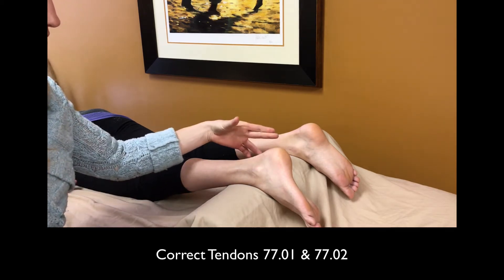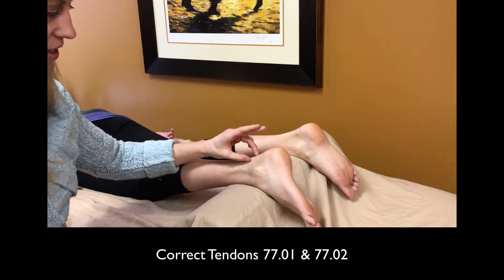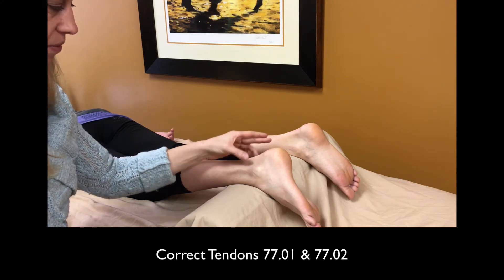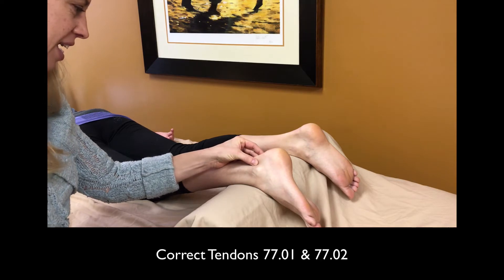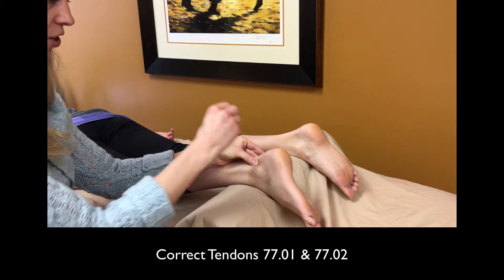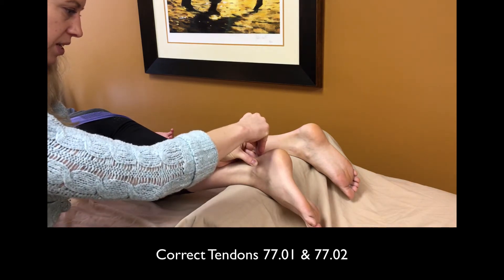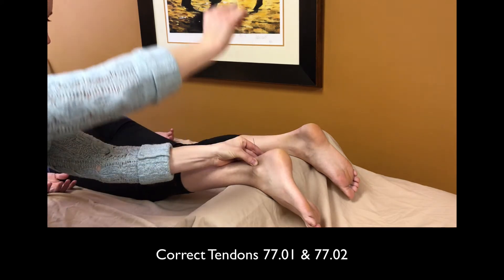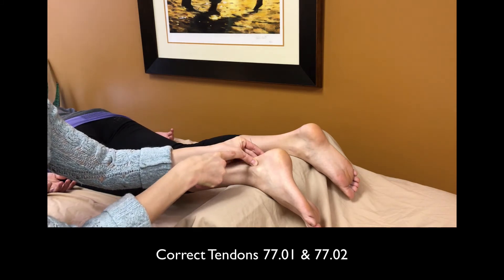To needle the correct tendon points, you want to find the apex of the Achilles tendon right between the medial malleolus and the lateral malleolus. I have already swabbed the skin here with alcohol. You want to pinch the Achilles tendon to hold it in place, then insert the needle perpendicular — press that down firmly in the middle, tap it in, and it should be perpendicular right here to the Achilles.